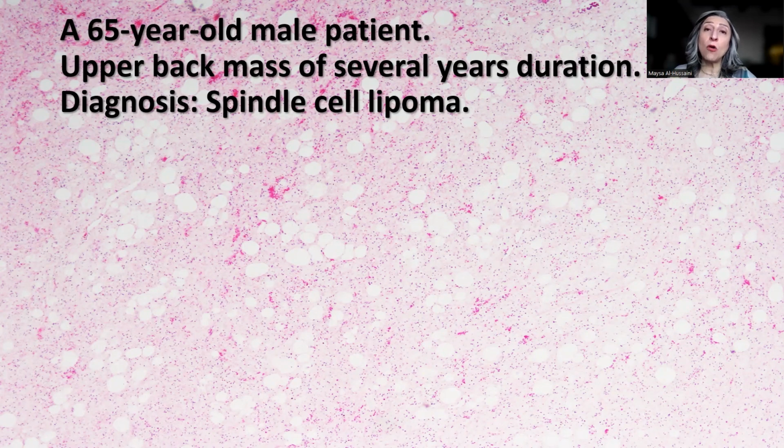Once you are aware of the typical clinical presentation, as well as the location, in addition to the morphologic variation, in particular the 4 components that I've just mentioned, in addition to the positivity with CD34, then the diagnosis can be rendered easily. I hope you find this tip useful in your daily practice.